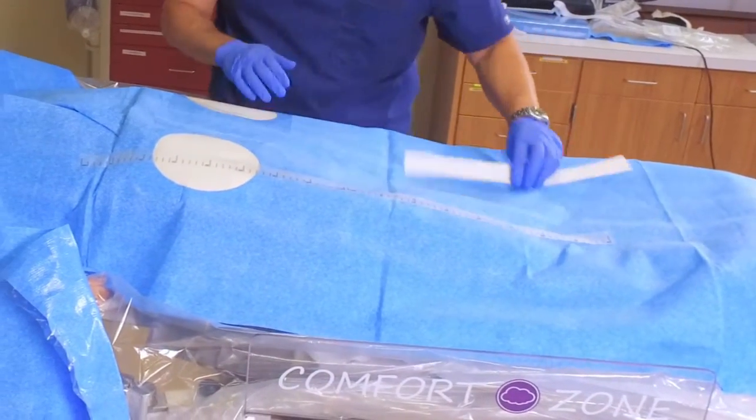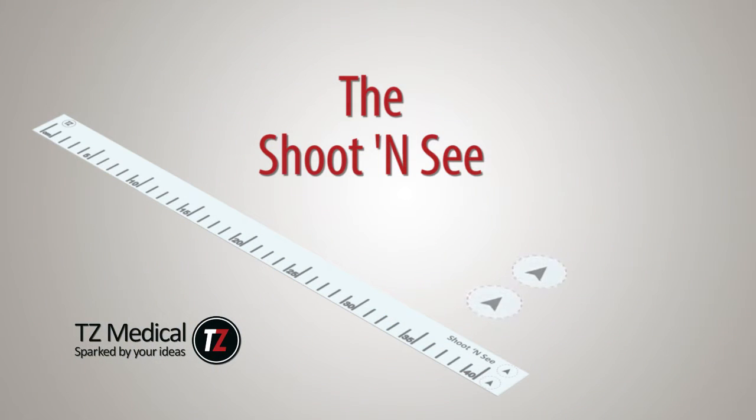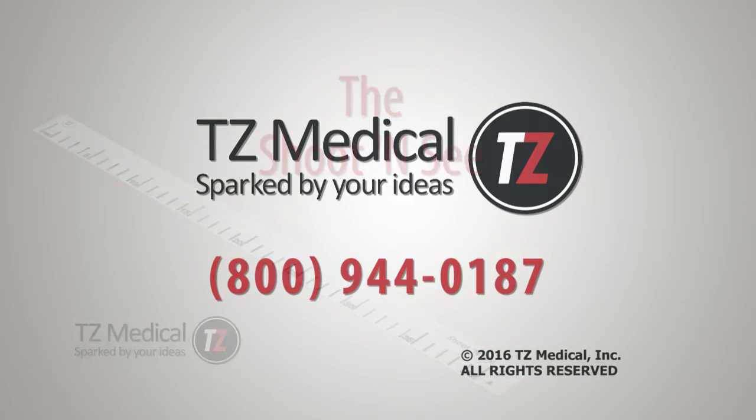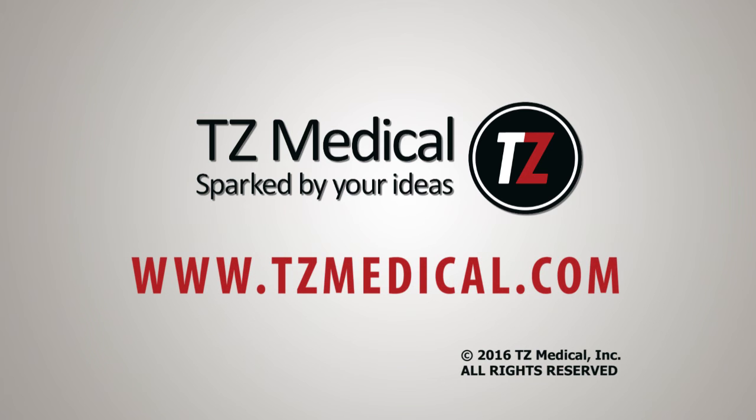In addition to the radiopaque ruler, the Shoot and See has two markers that can be removed from the ruler and placed where needed for marking lesions prior to treating, for added accuracy in stent placement. For more information, call TZ Medical at 1-800-944-0187 or visit us online at tzmedical.com.